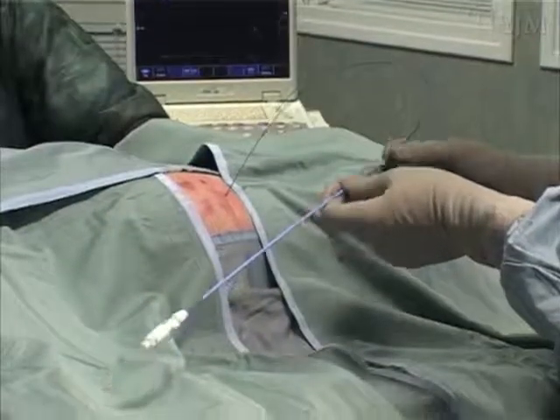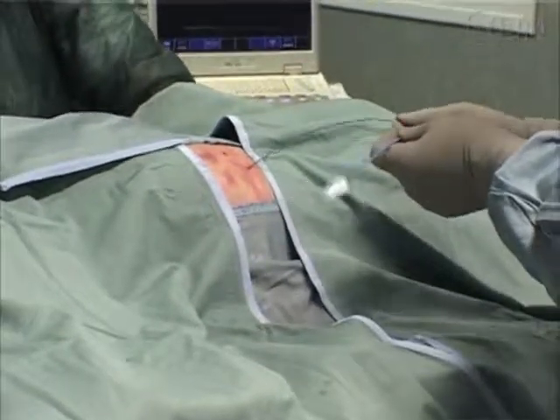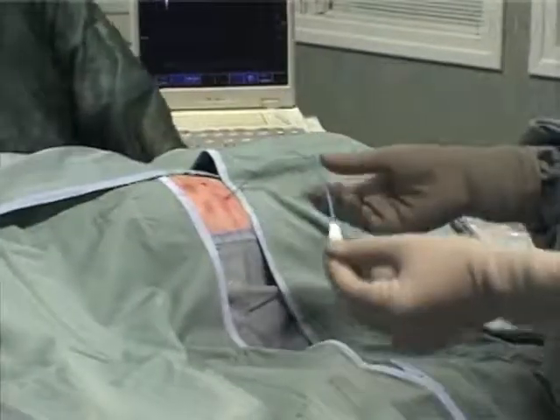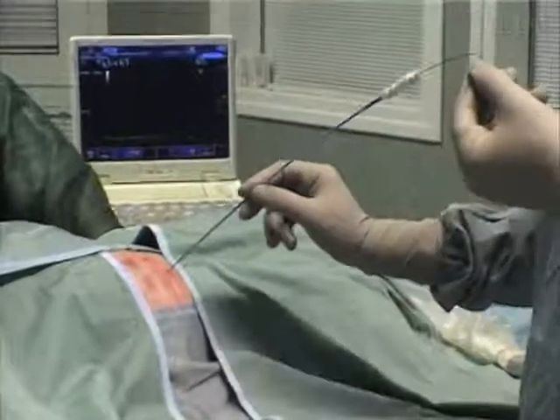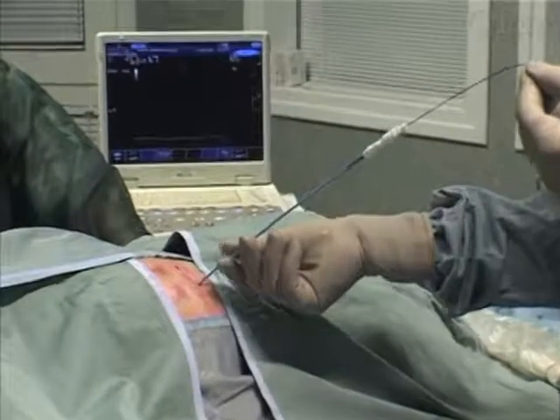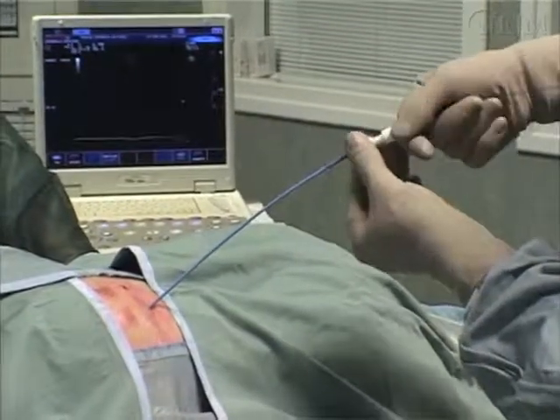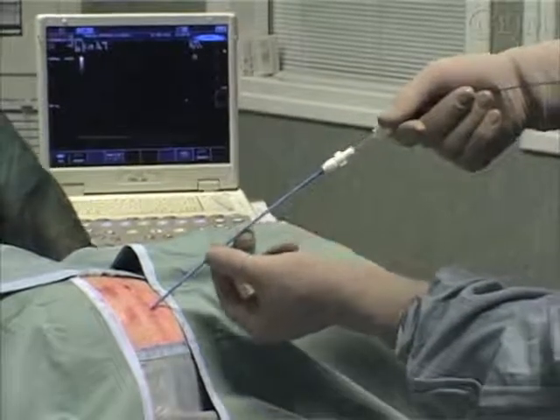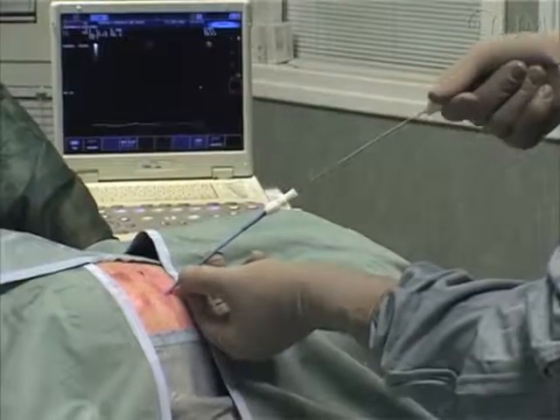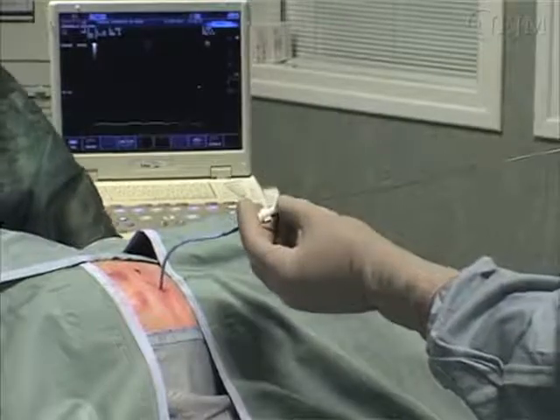Slide the previously assembled catheter, with the stiffening cannula in place, over the wire. Make sure that the wire extends out of the proximal part of the catheter. Then advance only the catheter by half of its length, holding both the cannula and the wire firmly, to avoid any damage to the lung. Once the catheter has been inserted, completely withdraw the wire and the inner stiffening cannula together. With your finger, close the proximal hub of the catheter quickly to prevent any aspiration of air, which is a risk particularly for patients who are breathing spontaneously.